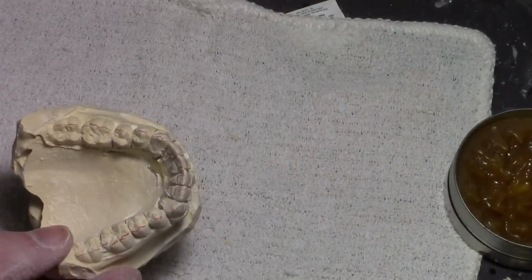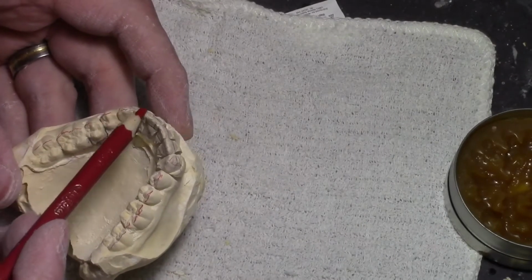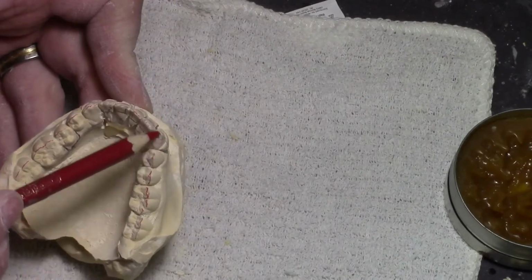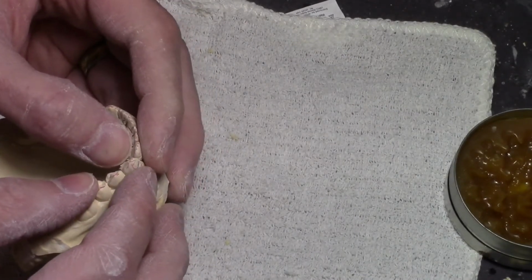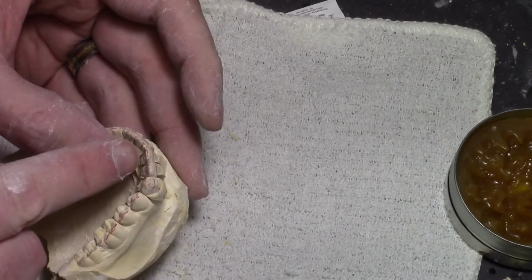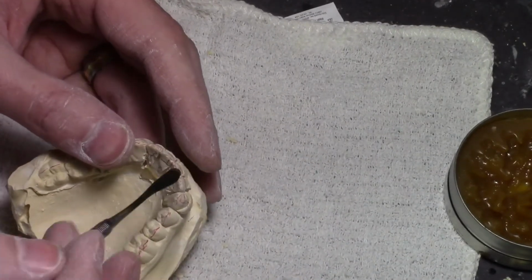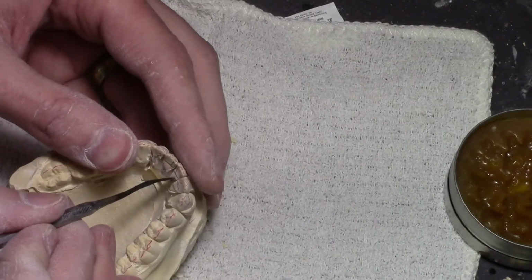So there we go. So if I continue on, now this isn't going to be perfect because this case has some issues. This is still kicked out a little bit, so I'm going to try to push it in, push that 2 out a little bit. This is rotated a little bit, so I'm just going to try and rotate it. There we go.